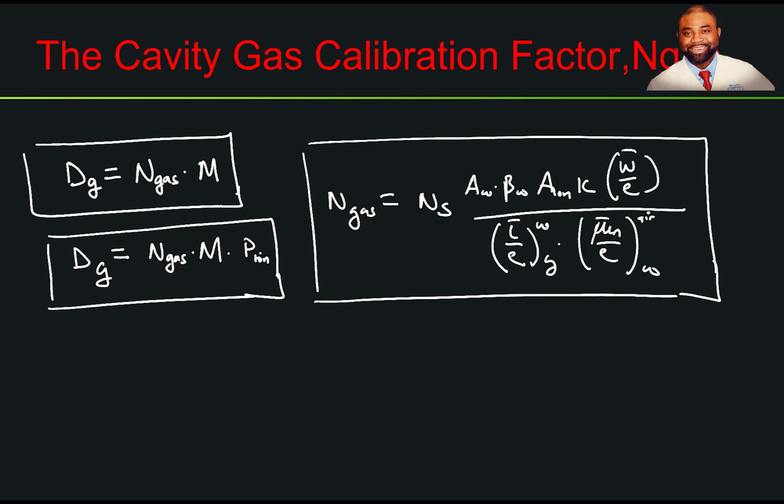I don't expect you to remember that, because I don't remember the equation myself. I'm not even trying to memorize the equation, but the important thing is we should be able to explain how to use this equation. And so I'm going to end this lecture really by summarizing a few things on how TG21 is applied in the clinic.